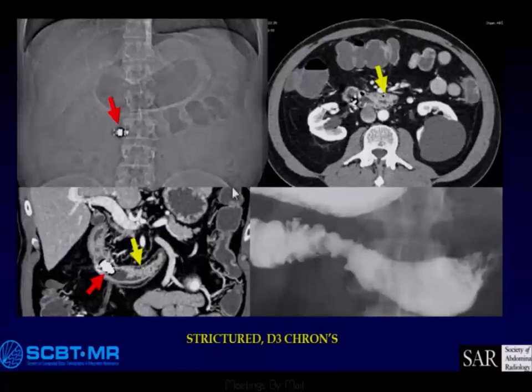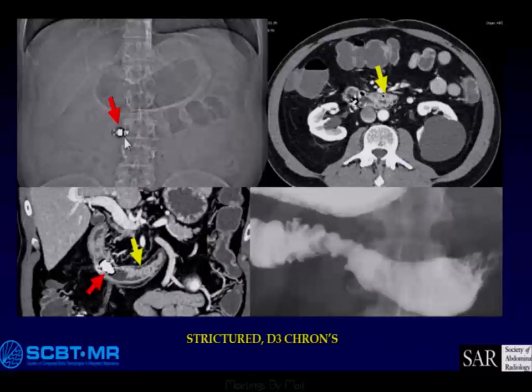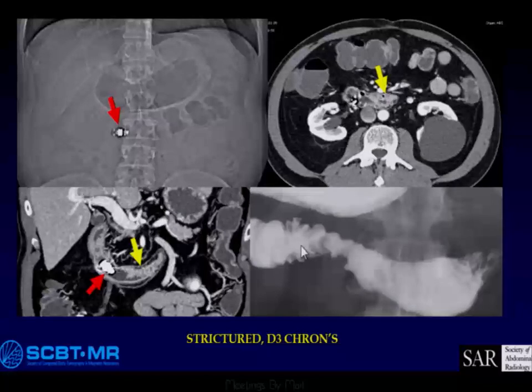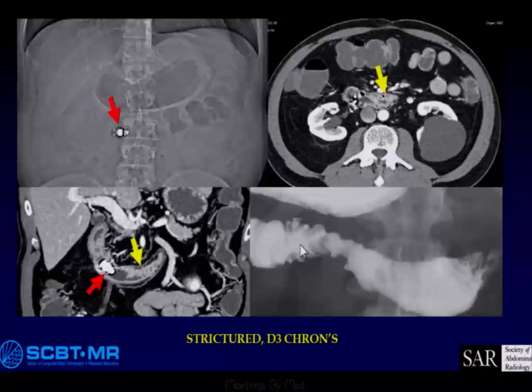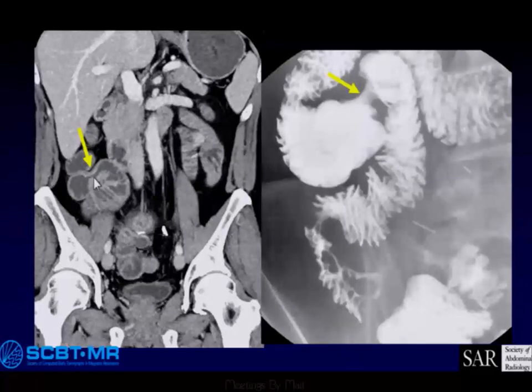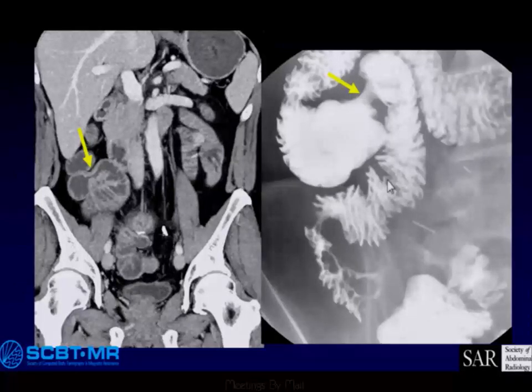Here are two examples. In the first, the gastroenterologist didn't read prior reports and gave a capsule — there's the stricture, there's the capsule, and no hyperenhancement. Here's the barium study done several months before the CT enterography. And here's another example with good barium correlation: there's the stricture without active inflammation, no hyperenhancement, and there's the stricture on the barium study.